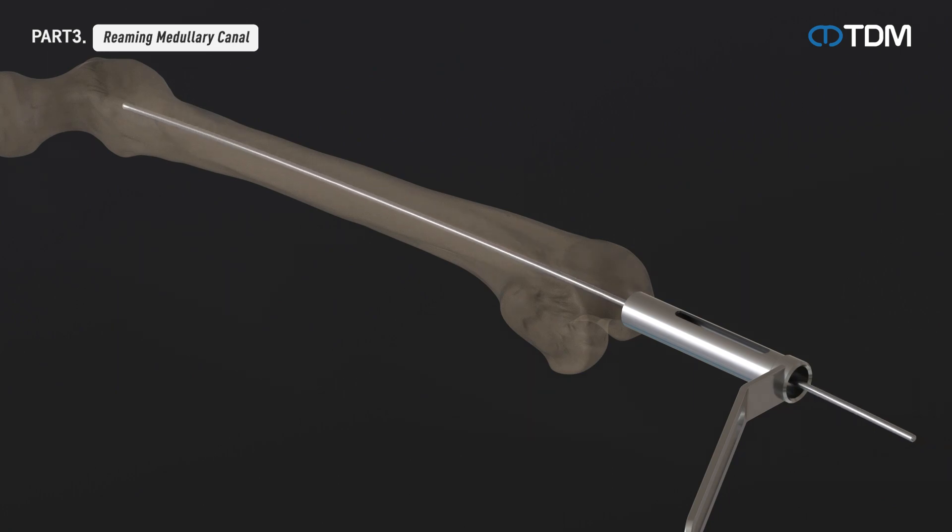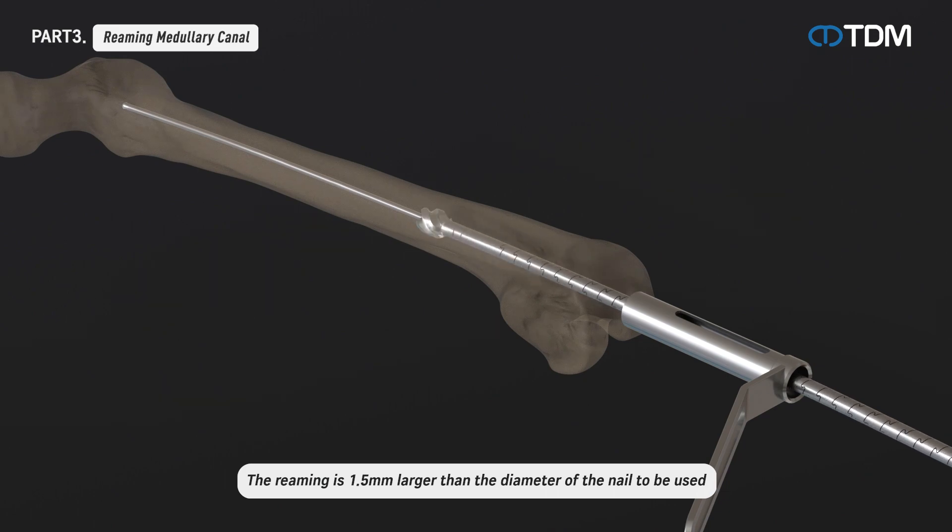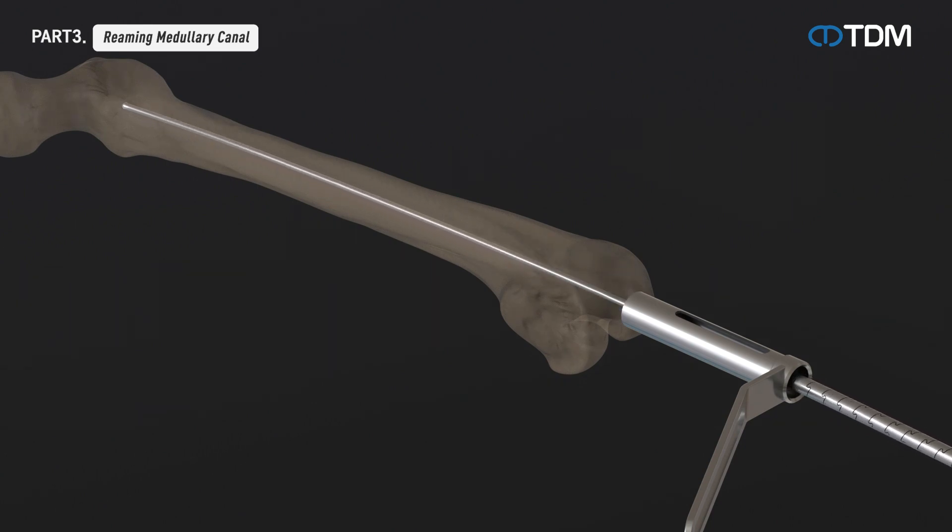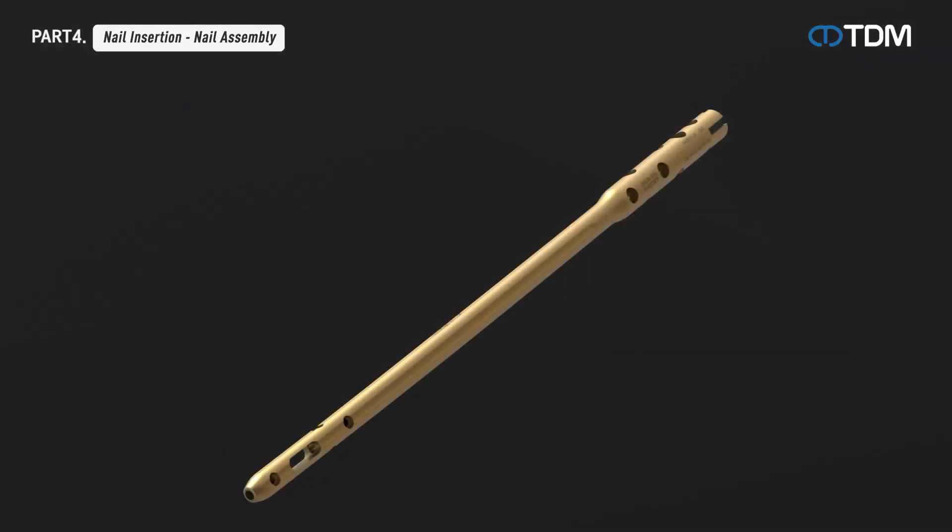Insert the reaming rod with the ball tip to the desired depth. Using a flexible reamer shaft, reaming is carried out along the reaming rod to the desired size by starting with an 8.0 millimeter reamer head and increasing by 0.5 millimeters. The reaming rod with the ball tip is not removed even after reaming is completed.